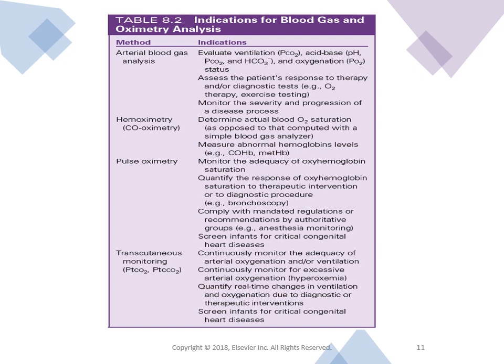Table 8.2, pictured here, outlines the indications for blood gases and oximetry analysis. It's pictured on page 146 in your book. Make sure to review it.